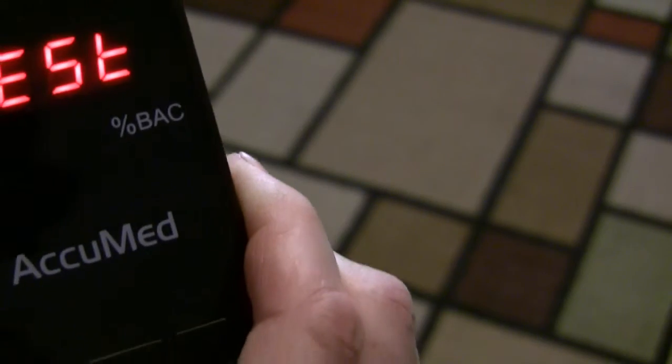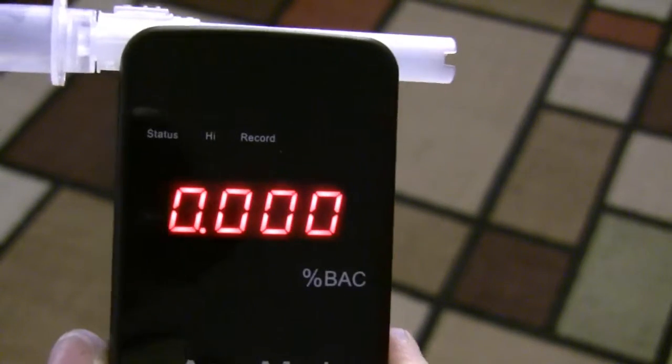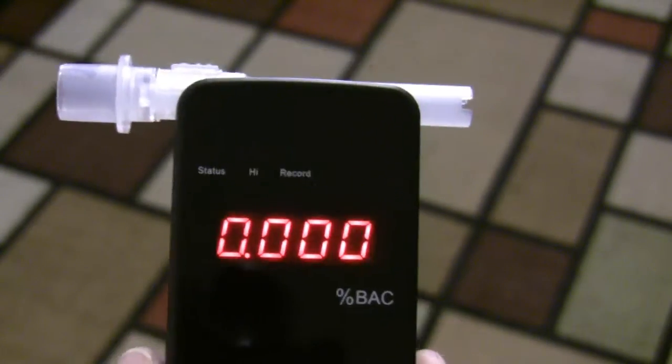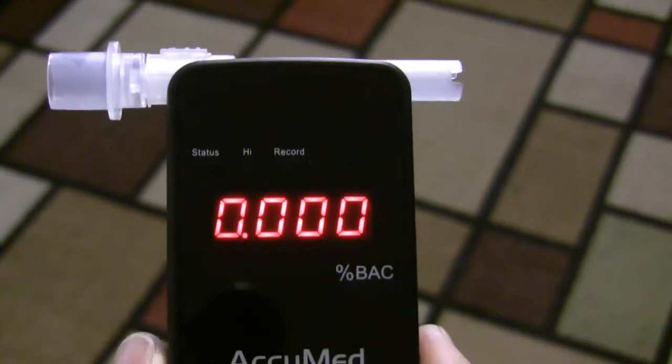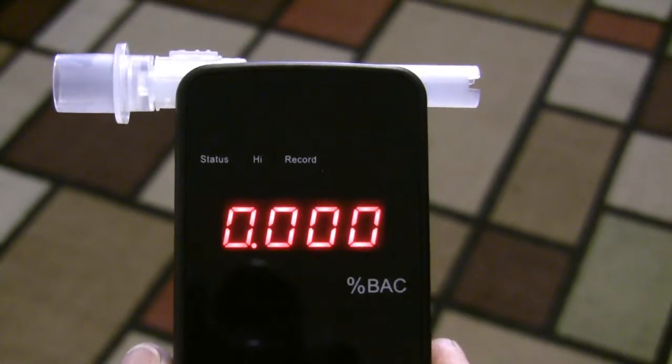Okay, so here I go. All right, so now it is analyzing it and there it is — 0.000 — which it should be because I've not had any drinks. So I'm going to check back a few hours later this evening after a couple of beers or something like that and we're going to see what it says.